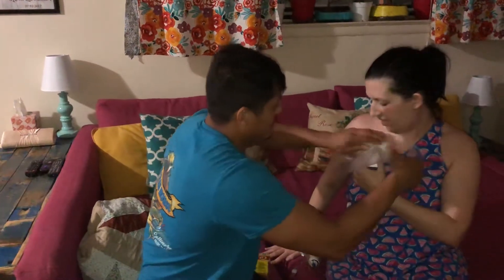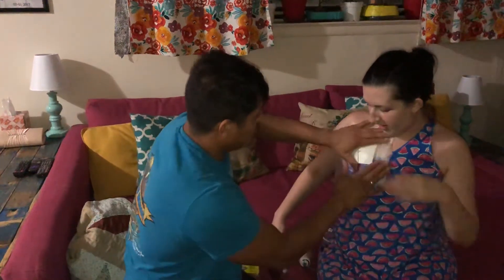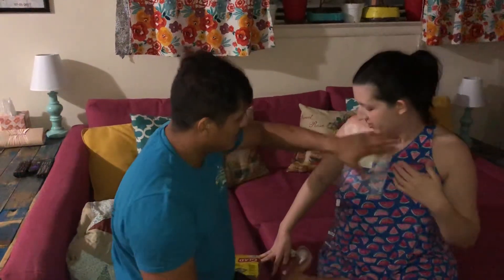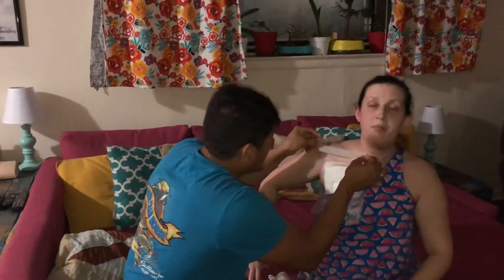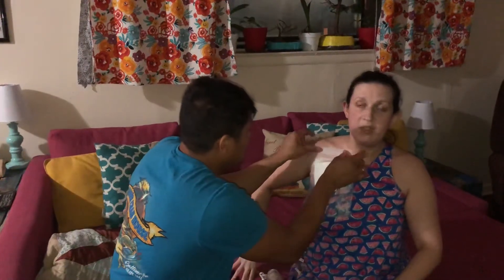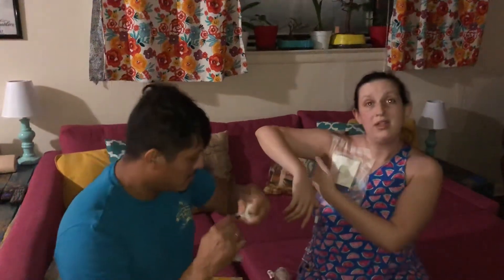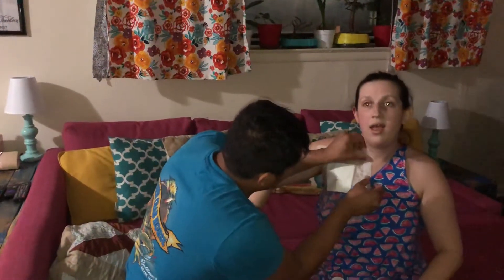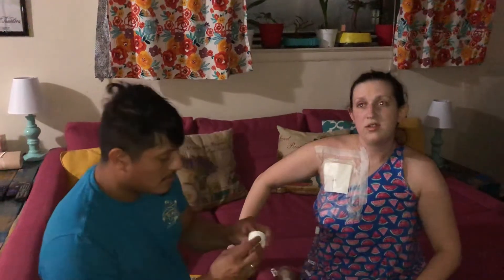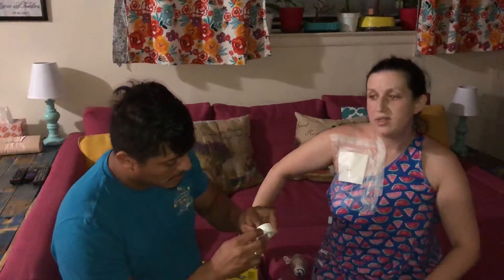You just want to pick a piece — and to be correct for the internet, he's using my gown versus my skin just to demonstrate. But pretty much there's no perfect way to do it. You're just trying to cover the area and a little bit beyond where the chest port is placed. It kind of goes into my underarm area, which makes it a little difficult because the tape goes right on the side, but we do the best we can. Then we take the edges to add an additional barrier layer so that water hopefully does not get through.